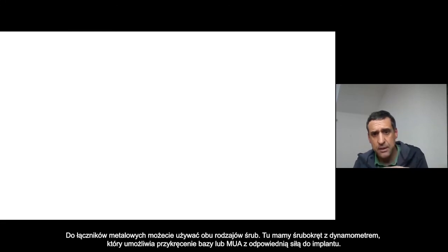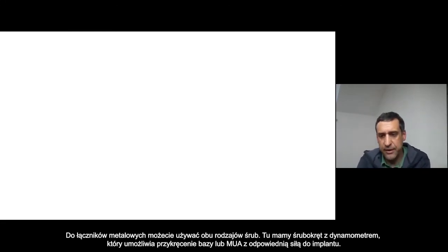For metal, you can basically use both screws. Here you can see the screwdriver set — you also have a dynamometer tool that allows you to screw exactly at the right strength you want to have the T-base or the multi-unit on top of the implant. You have different heights of screwdrivers — you can use the same base but different height screwdrivers.